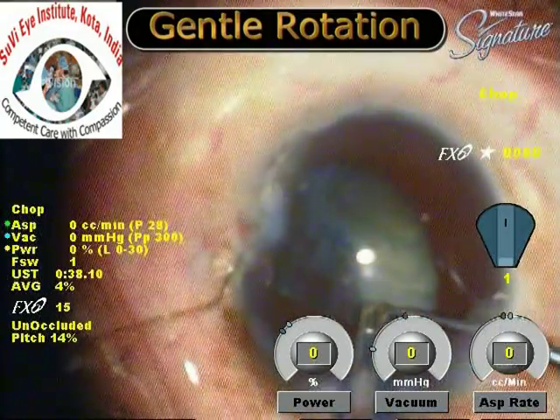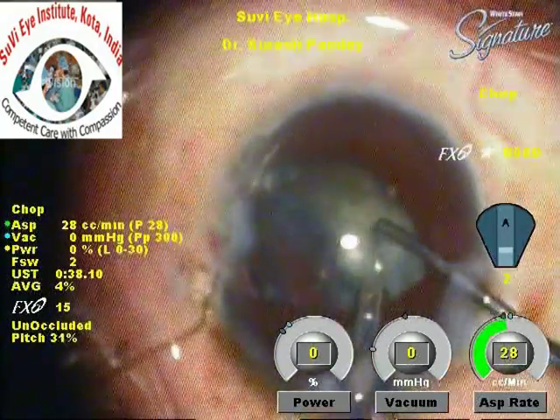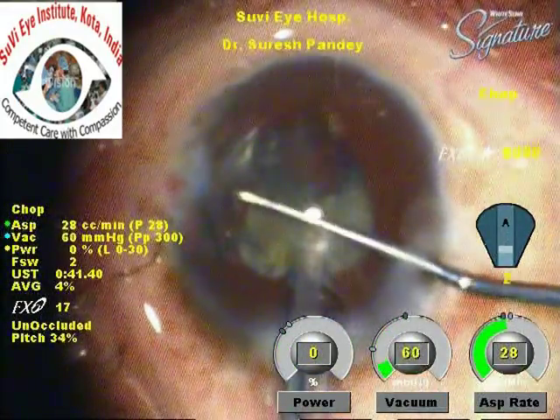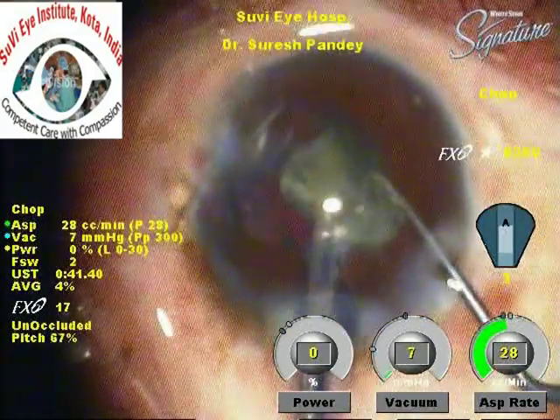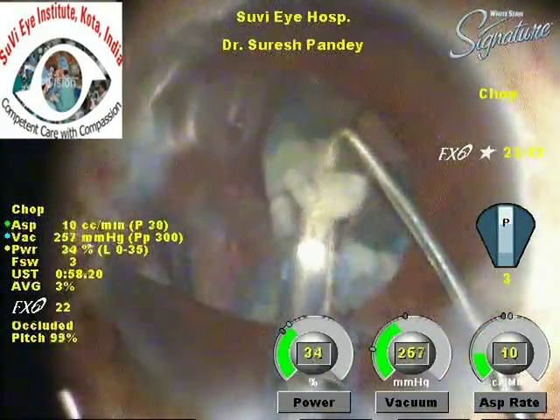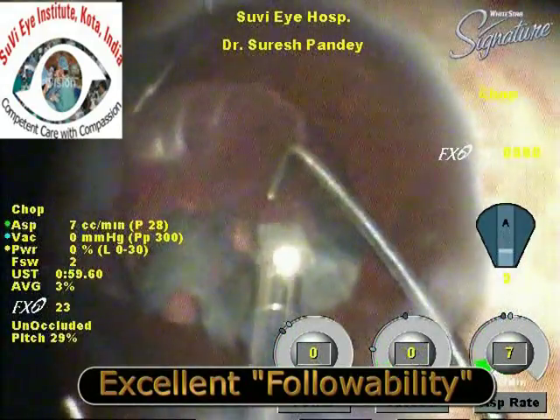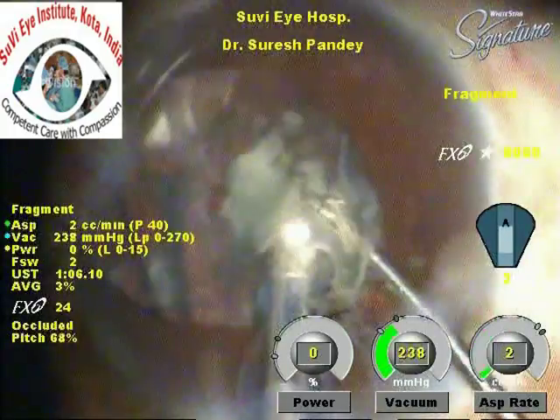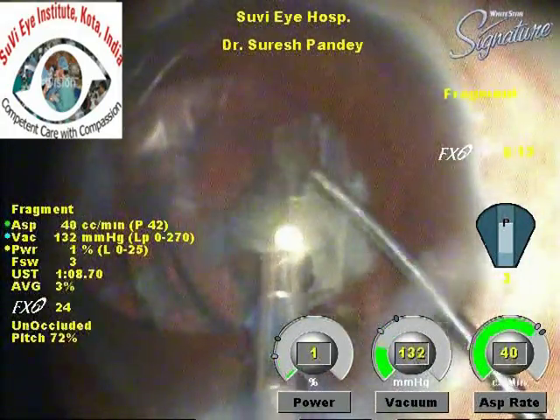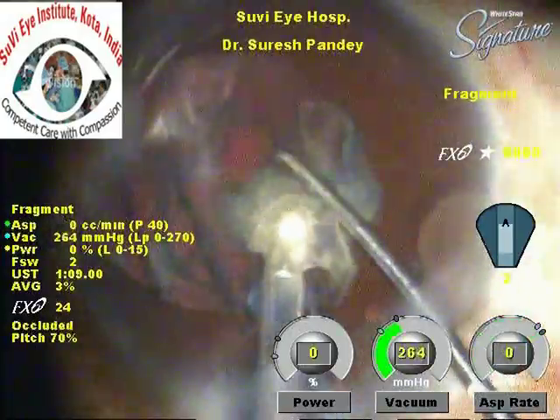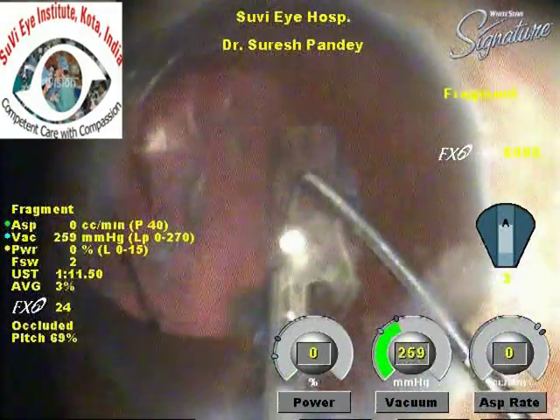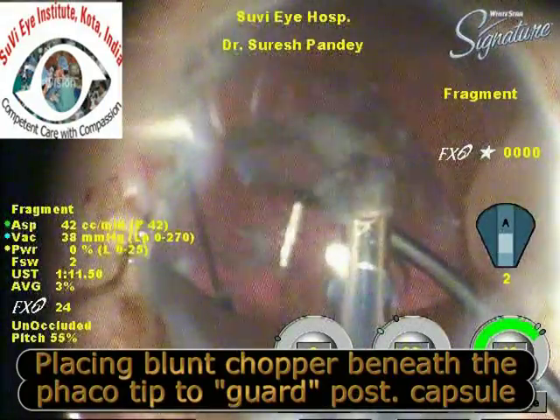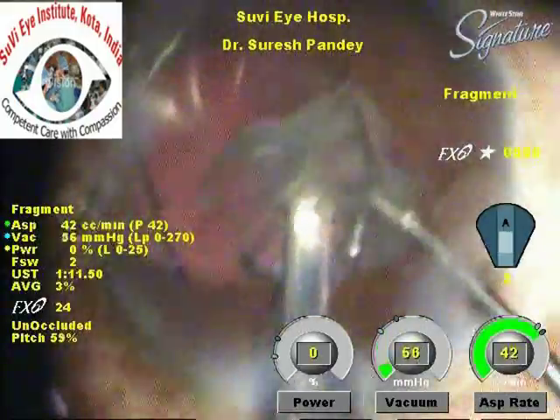We lift the nucleus slightly and do not perform phaco maneuvers exactly in the bag. Rotation must be very gentle, using a lot of viscoelastic to ensure minimal rotation that does not put further stress on the compromised zonules. Especially when removing the last nuclear fragments, it is a good idea to place a second instrument below the phaco probe, because in these cases the posterior capsule is quite floppy and may inadvertently be caught by the probe.